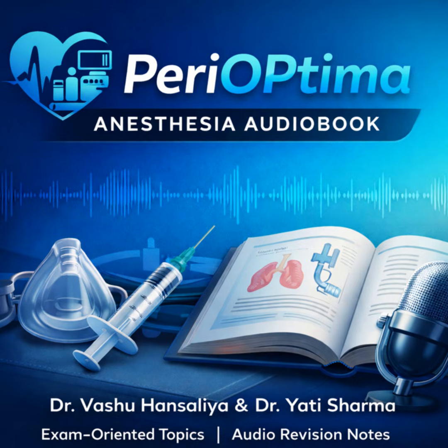We also need to discuss the rapid delivery mechanism that's independent of the main circuit, the O2 flush. What are the pros and cons of this really powerful tool? The backup oxygen flow mechanisms, especially the O2 flush valve, are essential safety tools. What happens when you press it? It bypasses the flowmeters and the vaporizers and delivers a massive instantaneous flow of pure oxygen. How massive are we talking? Typically between 35 and 75 liters per minute. And it goes directly to the common fresh gas outlet or the breathing circuit.